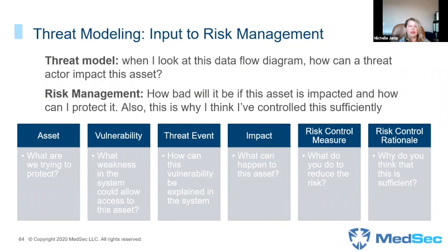So it is really easy to take a threat model and let it morph into more than it's supposed to be. So my recommendation, as you're working threat models and risk management and trying to integrate them, is to make a very clean, bright line between what belongs in the threat model and what belongs in the risk management side.